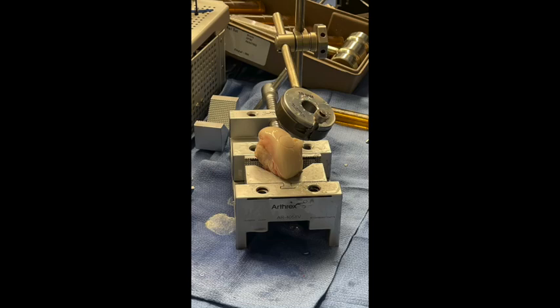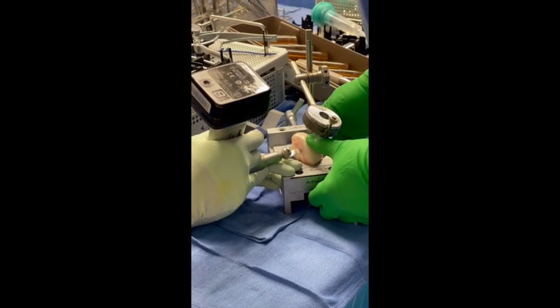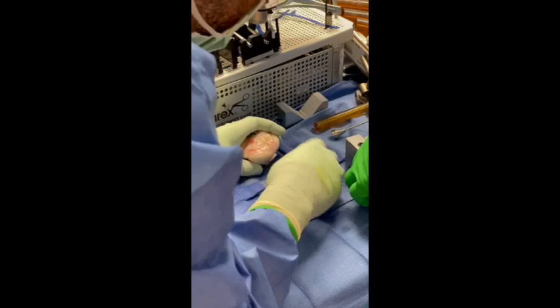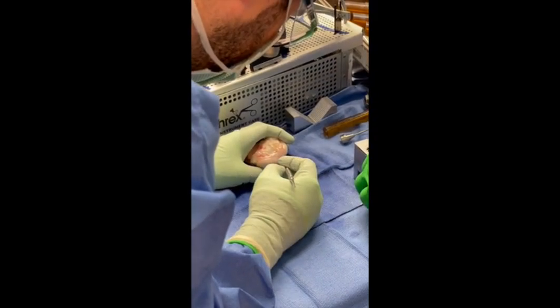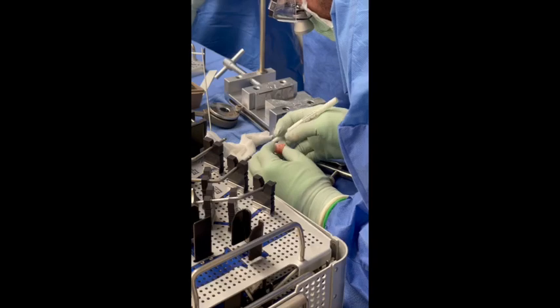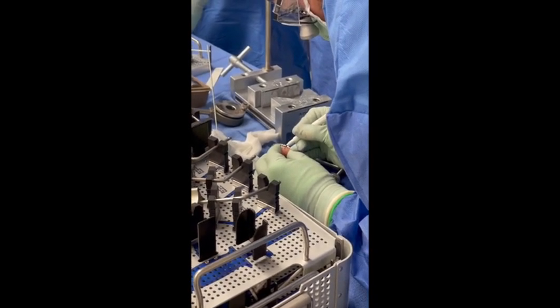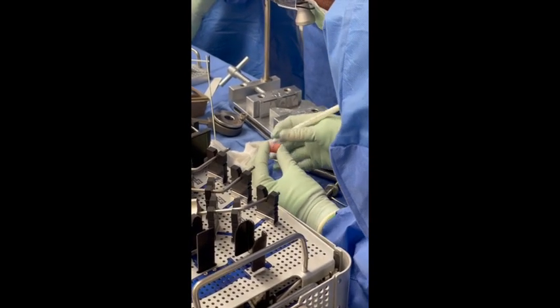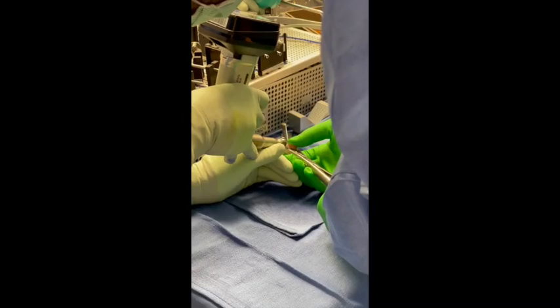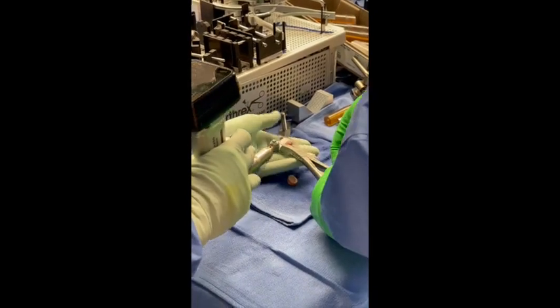After confirmation of appropriate graft size and contour, the graft was then cross-cut at a depth of approximately 12 millimeters, and the plug was removed and contoured appropriately. Correct orientation and depth for inset were again confirmed and marked, and the plug was recut to the appropriate depth to match the depth measured in the capitellar lesion itself.